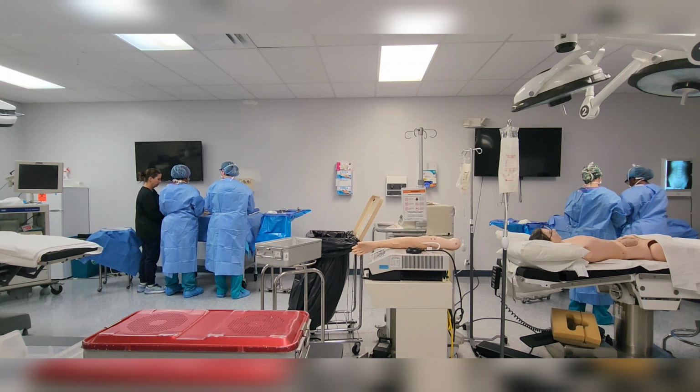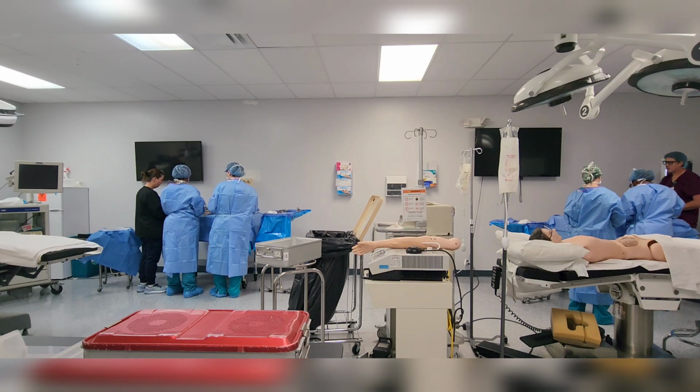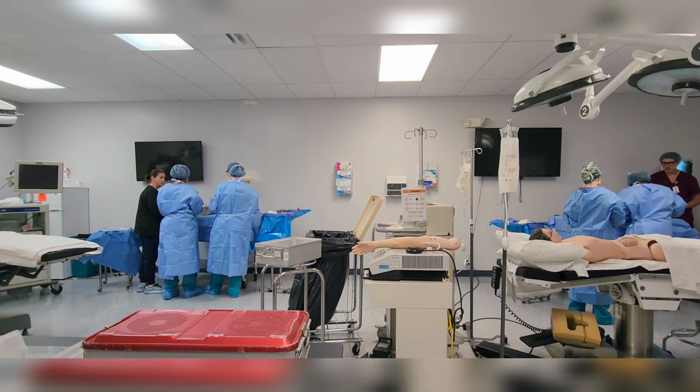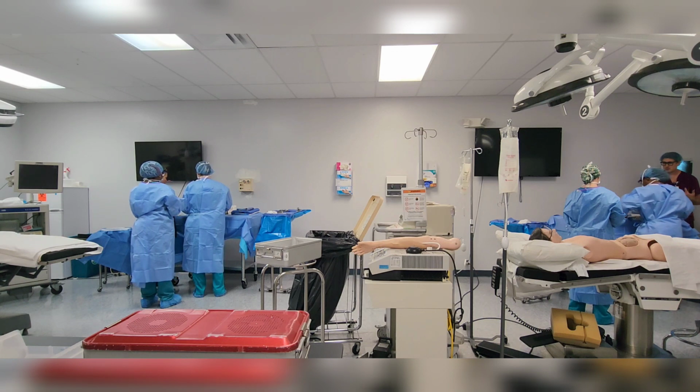Okay. So now when you get your needle loaded, I'll show you something. What I usually do, now you're never going to use this small of a needle. This is a good example of the real world. I can either go really quick, or I just kind of leave it sit like this. You will conquer an open appendectomy. I've been in this kind of scenario where I feel like I'm a hot mess and it just goes backwards. These are great learning experiences. Note to self: don't take off the stringer unless you're on a towel roll.